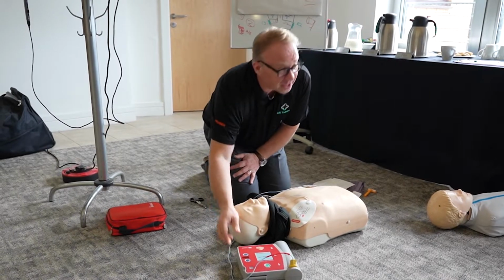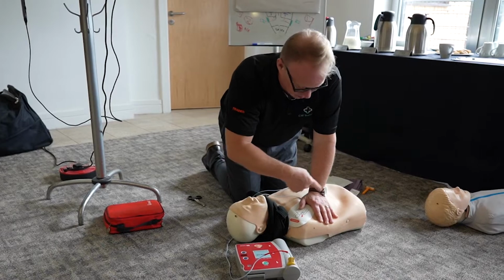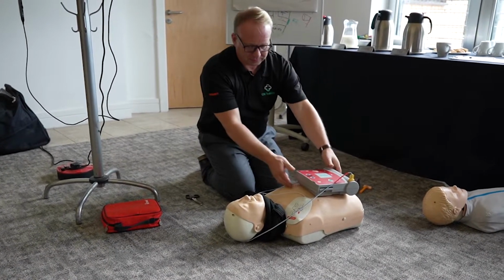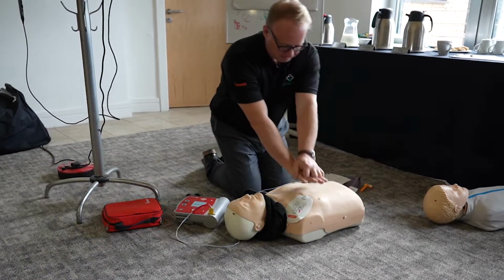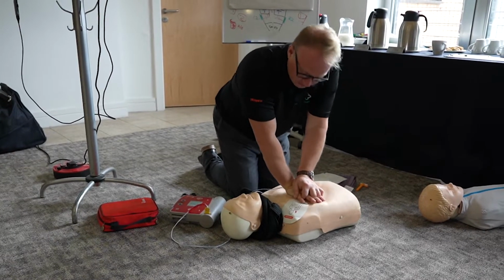Is that a good position for the defib? I'm just going to press it. Where's my hand? Deliver shock now. Press the orange button. Is that a good position? Shock delivered. Start CPR.